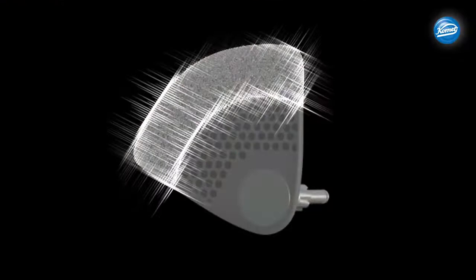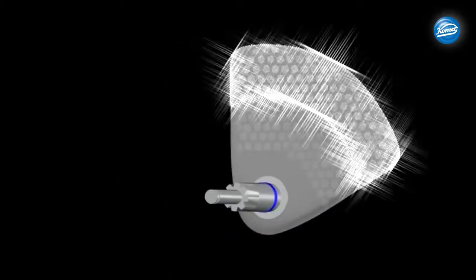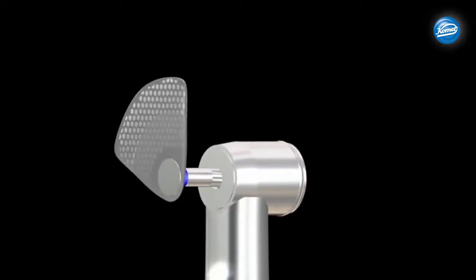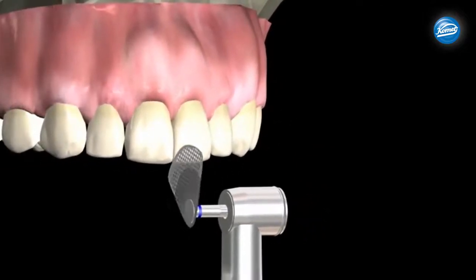Diamond discs are available in single or double-sided, with a range of different thicknesses and grits. Using the OS system will result in minimal reduction to tooth structure. There are 8 positions which allow for optimal access in lingual and buccal areas of the mouth.